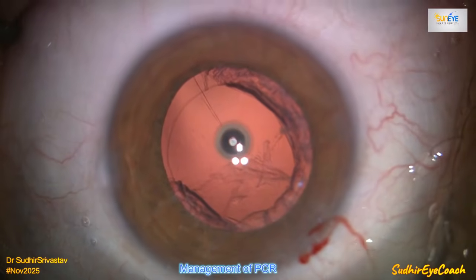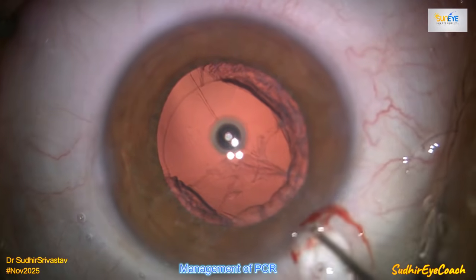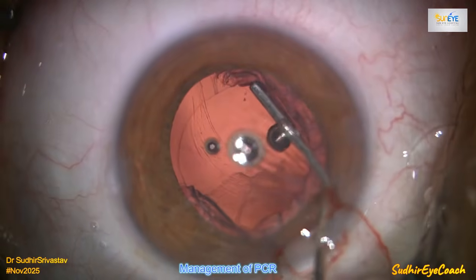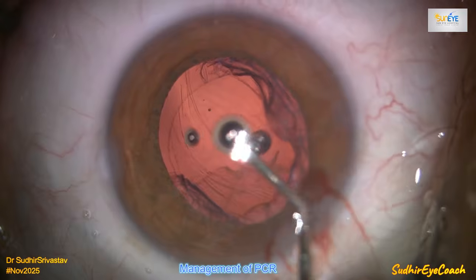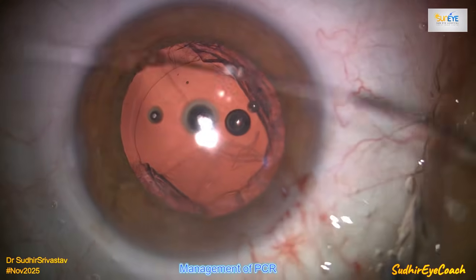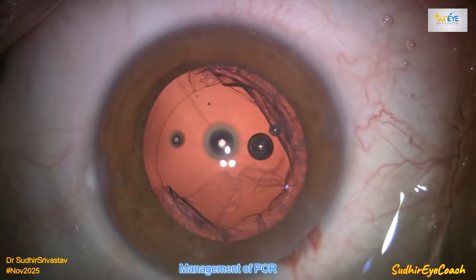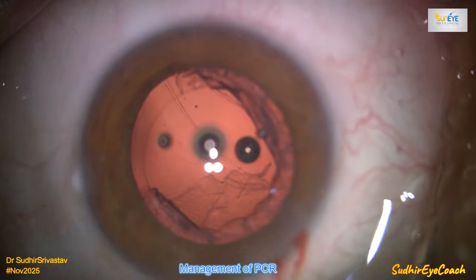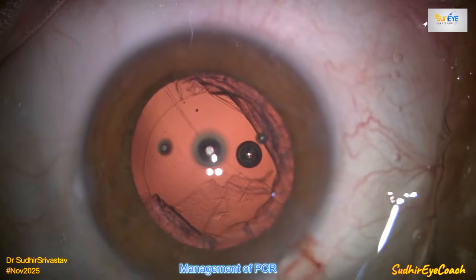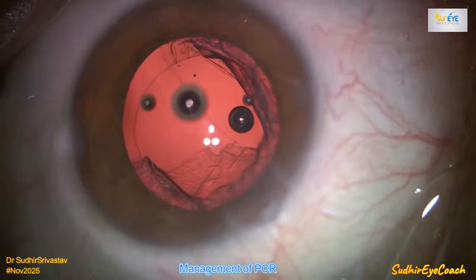The challenge now is to remove the remaining cortical matter safely and proceed with IOL implantation. It is always more satisfying if we can still place the lens in the bag, allowing us to consider this patient as a normal post-operative case. Fortunately, in this situation, there was no need for any kind of vitrectomy at this level. This is the moment where we must control our nerves and avoid panicking. Take a pause, plan your strategy, and proceed step by step.